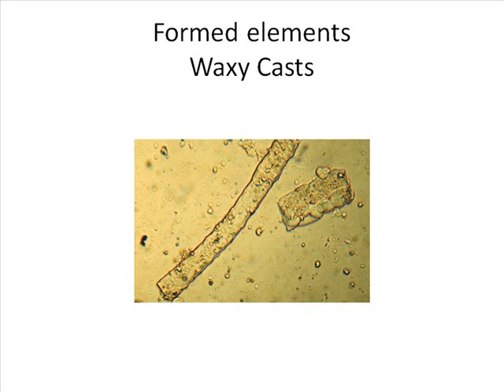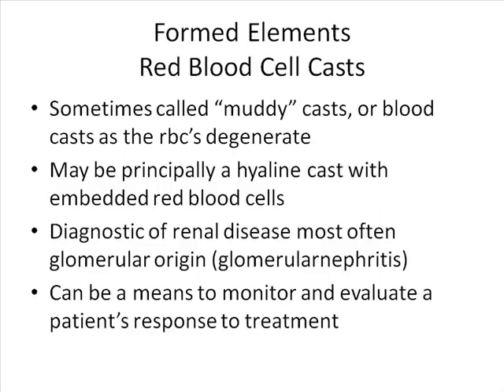This says waxy, but this to me almost looks like artifact every time I show this picture, because they're very outlined. Do you see this? I would like to look around and see more before I call this a waxy cast. But remember, there are other indicators. Does this patient have a lot of protein too?